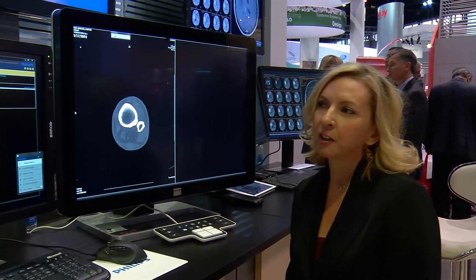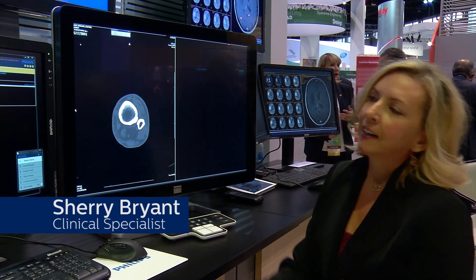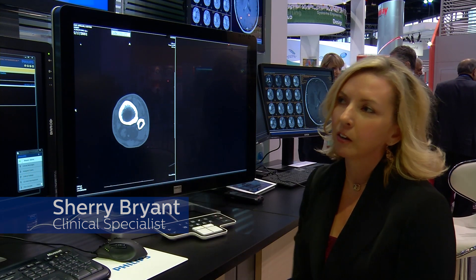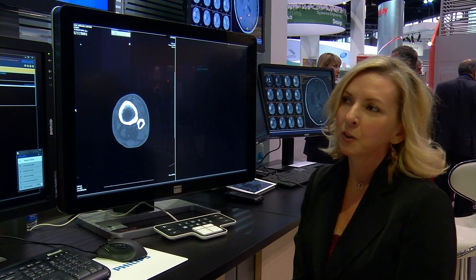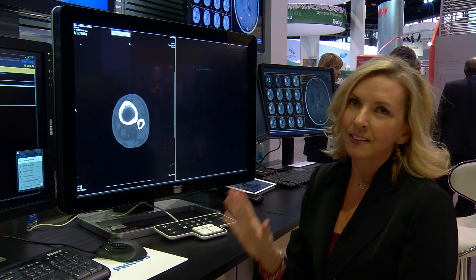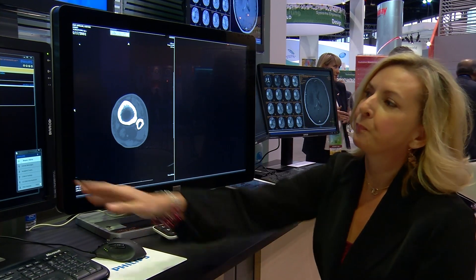This is Philips IntelliSpace PACS, and we have a unique user interface that all our customers and users have the advantage of seeing the same interface at all times.